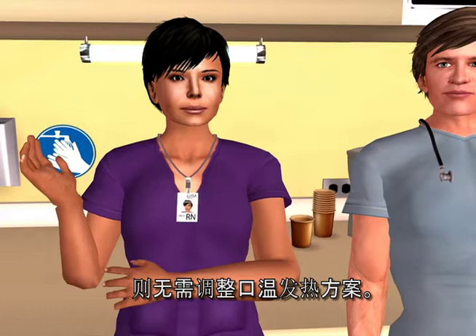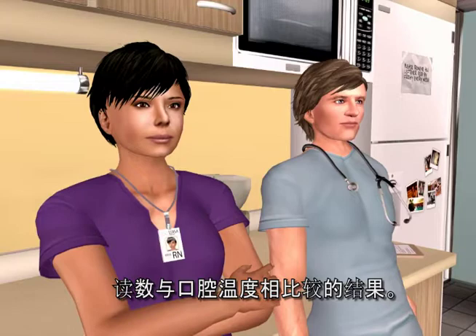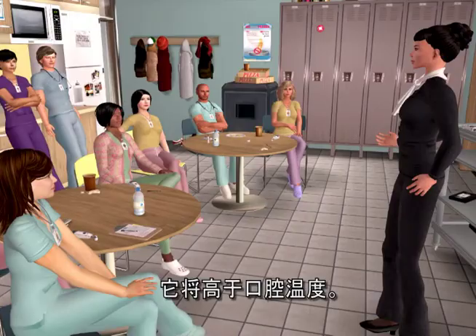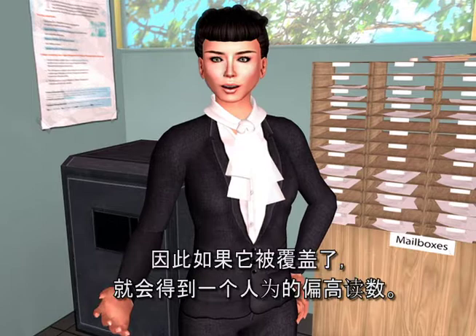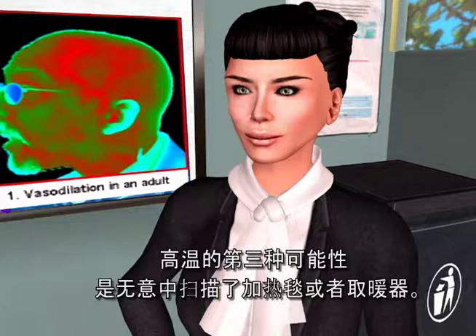High readings are typically the result of comparing an arterial calibration temporal scanner — which has a serial number beginning with an A — to an oral thermometer, since arterial temperature is a core temperature and will be higher than oral. Another reason for high readings is if the area being measured is not exposed; the temporal scanner assumes the skin has equilibrated to the room, so always allow about a minute after removing a covering before taking a temp. A third possibility for high temps is inadvertently scanning a warming blanket or a radiant heater.